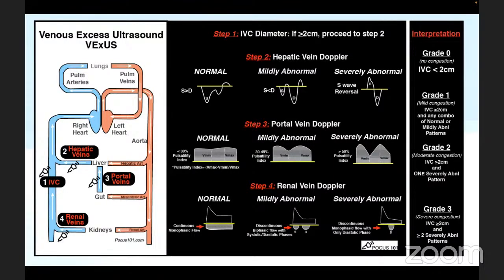But usually, if you're not able to appreciate it in the sagittal plane because of any incision, is there any approach in that condition to visualize the IVC? Any other view? In the coronal plane, yes, sir. In the coronal plane, we can appreciate it. In the coronal plane also we have to keep the probe in the subxiphoid position.